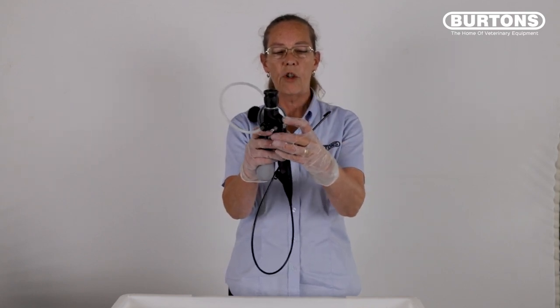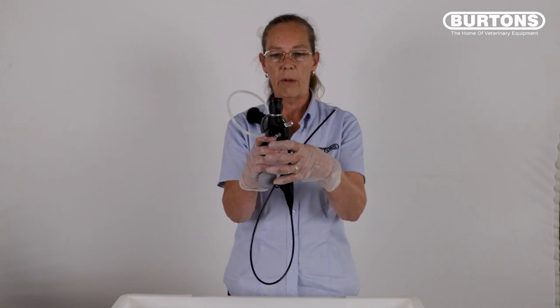Move the lever on the scope up and down to ensure you're not masking any small holes or perforations at the distal tip. If the needle holds steady, the scope is fine to be immersed. Depressurize the scope by pressing the button and detach the leak tester from the endoscope.